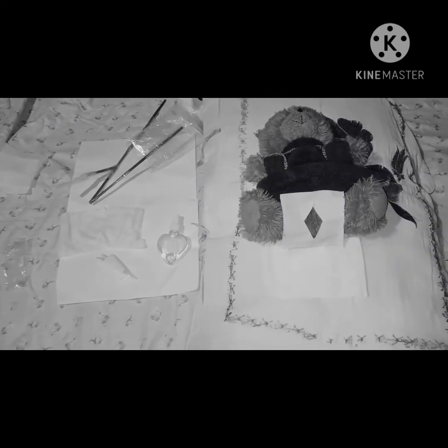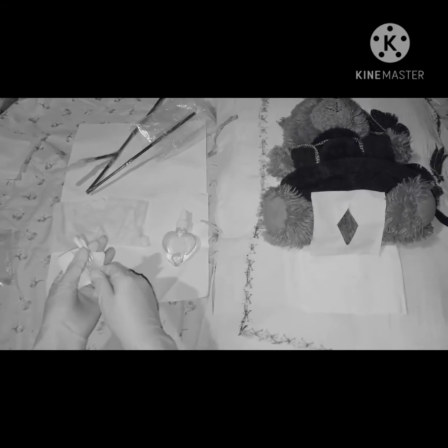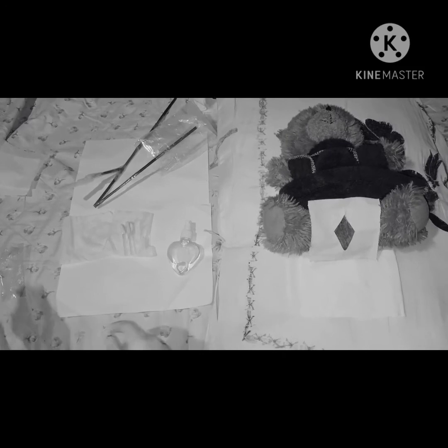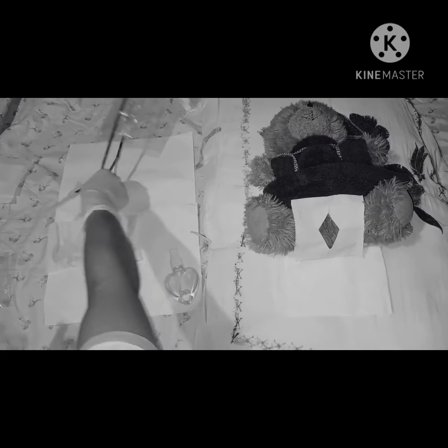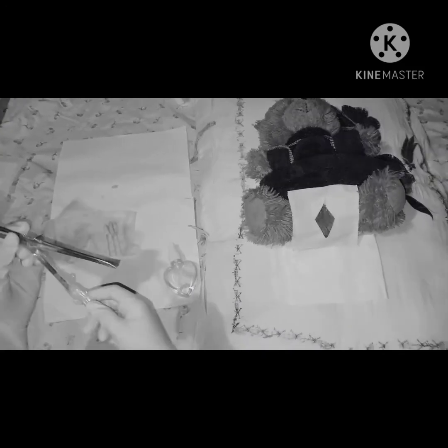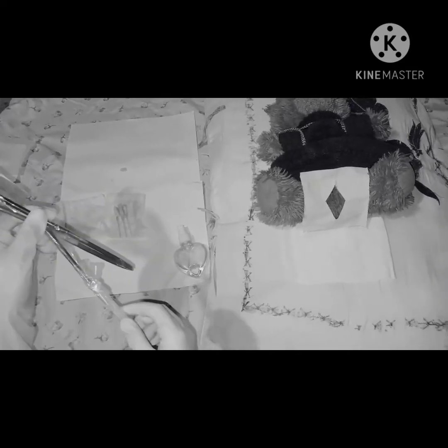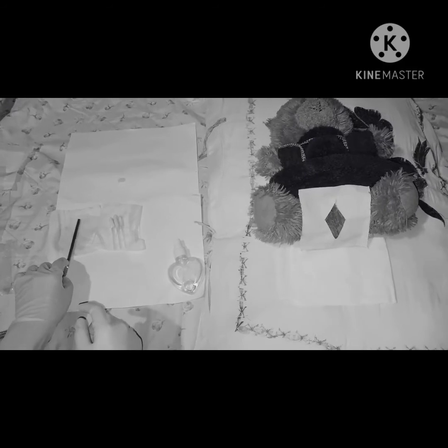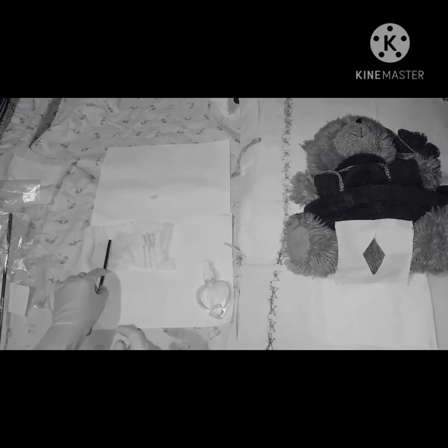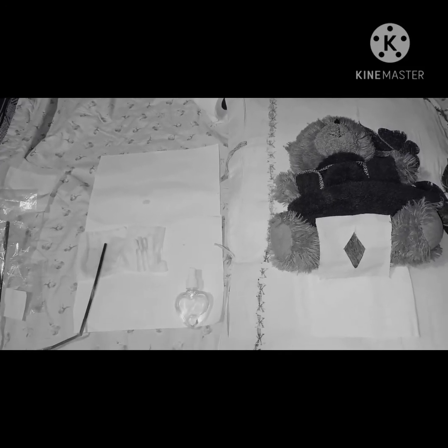So I have here the equipment. Here is my lubrication spray, and here are the 3 alcohol swabs. I'm going to make sure that the syringe is safely attached to the catheter tube. Since these are improvised materials, let's assume that this is the 10 cc syringe containing sterile water. I'm going to unpack the sterile tube cover and put it there. I make sure that the tube is lubricated.